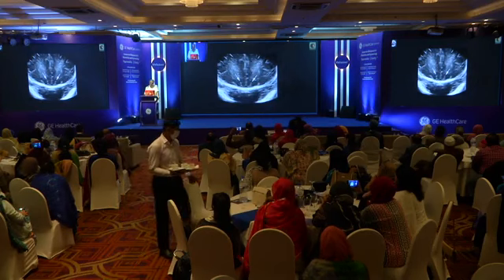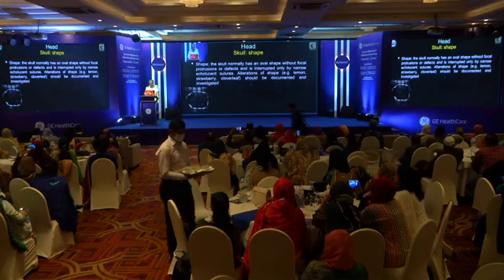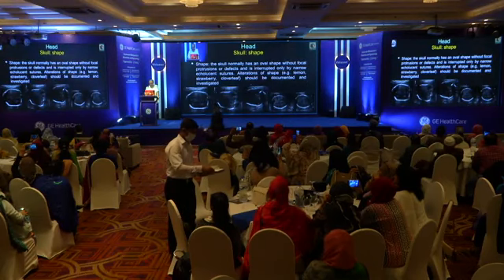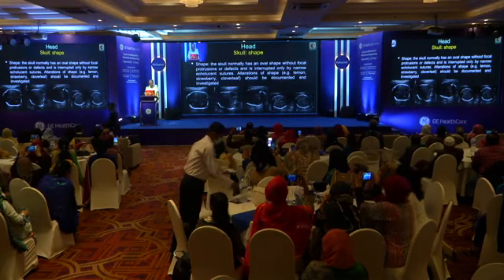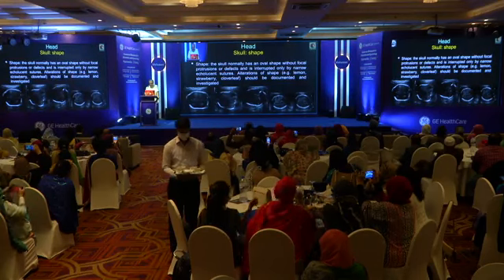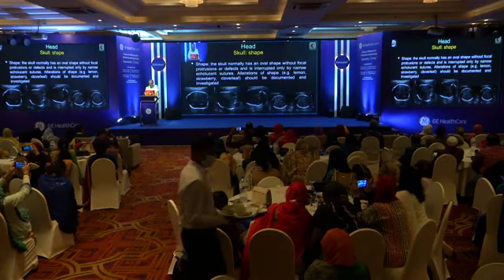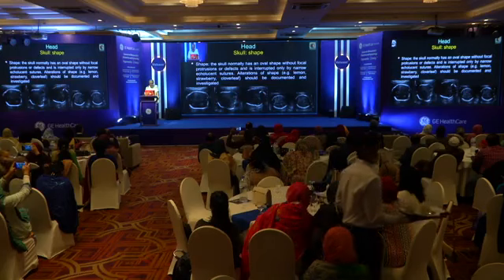There are certain subtle things you should always look for, which we often forget. One is that the skull should have an appropriate shape, and if it doesn't have the right shape, you know that the lemon shape is for neural tube defects, that this particular kind of clover-leaf skull will tell you about thanatophoric dwarfism, and a strawberry skull will tell you about trisomy 18.